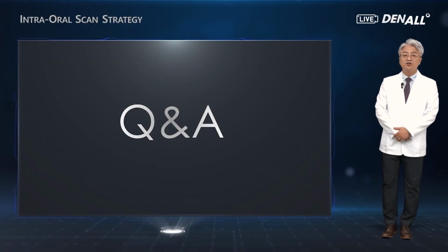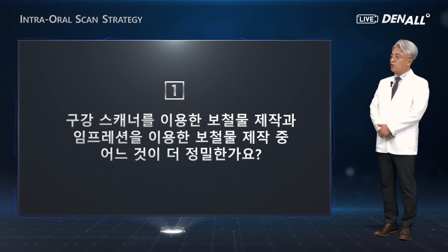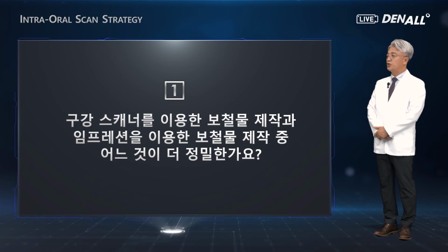Q&A session. Let's look at the questions. Which gives more precise prosthesis between oral scanner or impression taking?